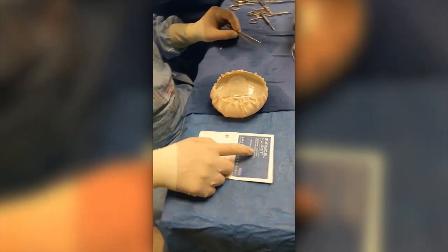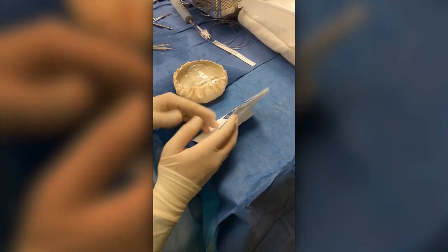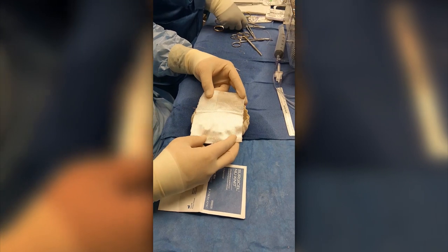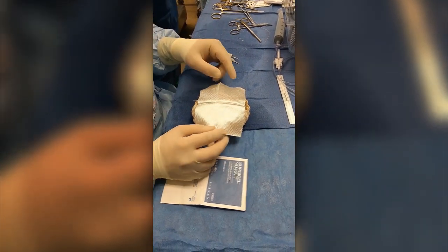We're going to use this as a Surgicell product, but it's actually something we can sew to. I've cut it in half — one piece of six by nine inches — and it's plenty large to do two breasts. This is a bilateral case; I'm going to lay this on the back of the device and cut it so it fits perfectly as I sew it into place.